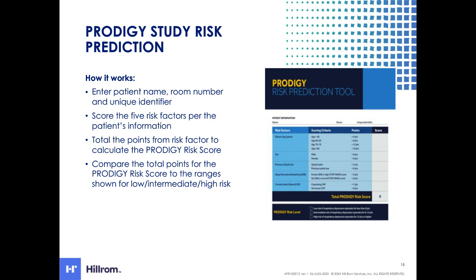High risk factors indicated by the study include age, sex, previous opioid use, sleep-disordered breathing, and known chronic heart failure. For example, 46% of patients receiving opioids on the general care floor experience respiratory depression, so it is extremely important to continuously monitor the patients in this group.